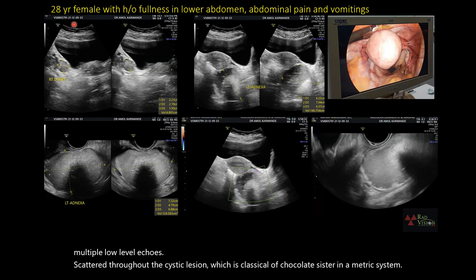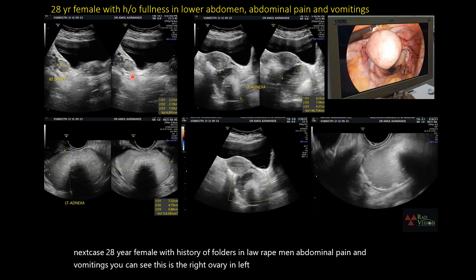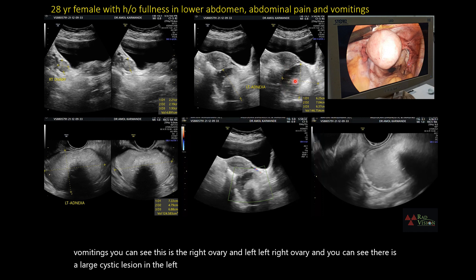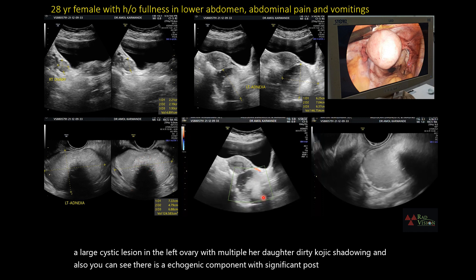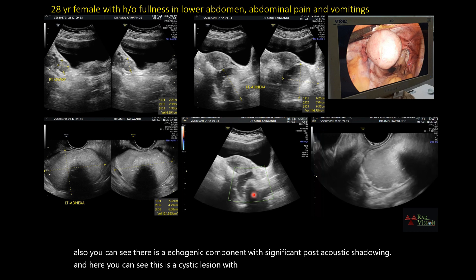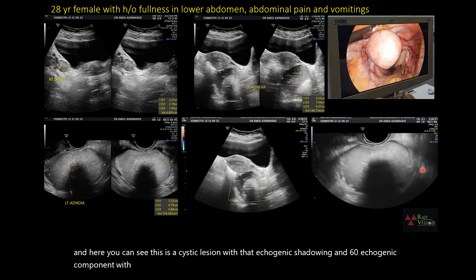Next case: 28-year female with issue of fullness in lower abdomen, abdominal pain and vomiting. You can see the right ovary, and in the left ovary there is a large cystic lesion with multiple hair and dot and dirty echogenic shadowing. There is also an echogenic component with significant post-acoustic shadowing. This is a classical case of dermoid.